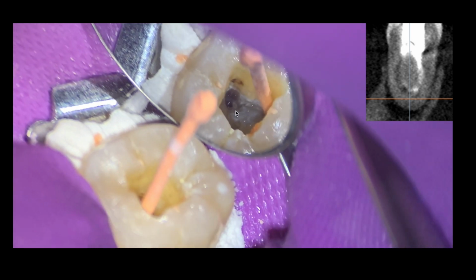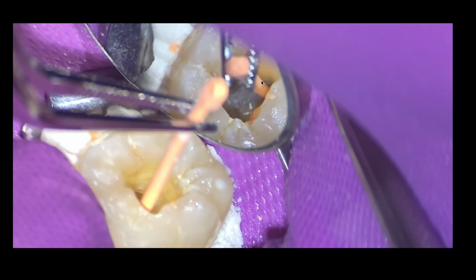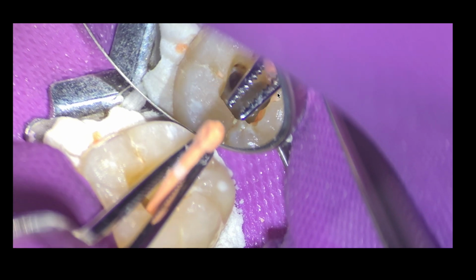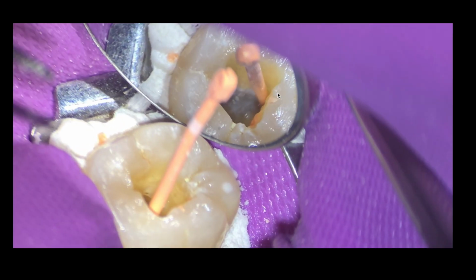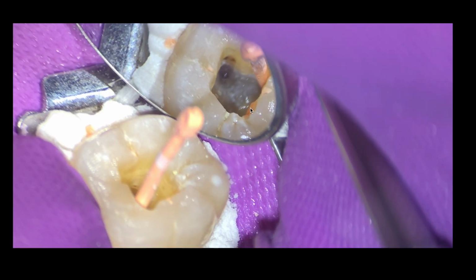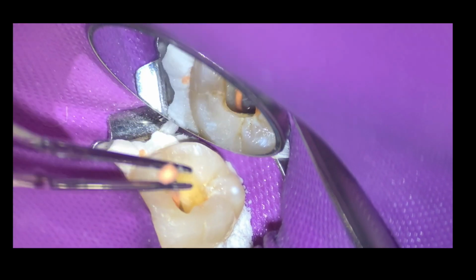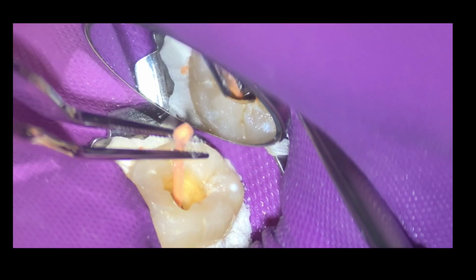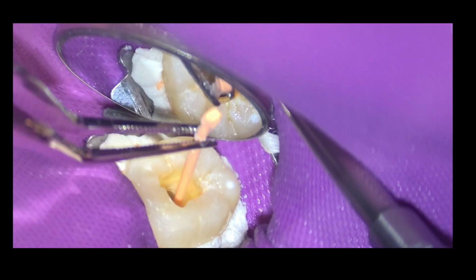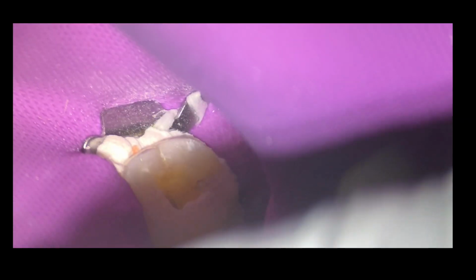Got to be careful when you're doing this manual dynamic activation, because you're putting a wedge in a wedge. The one wedge is your cone, and the other wedge is your canal. There's always a small possibility of extruding some sodium hypochlorite into the apical tissue, so you've got to be very careful. I wasn't too concerned in this case because I didn't have patency. But just keep that in mind. I have done it in clear teeth, and it actually works to clear out that apical portion.